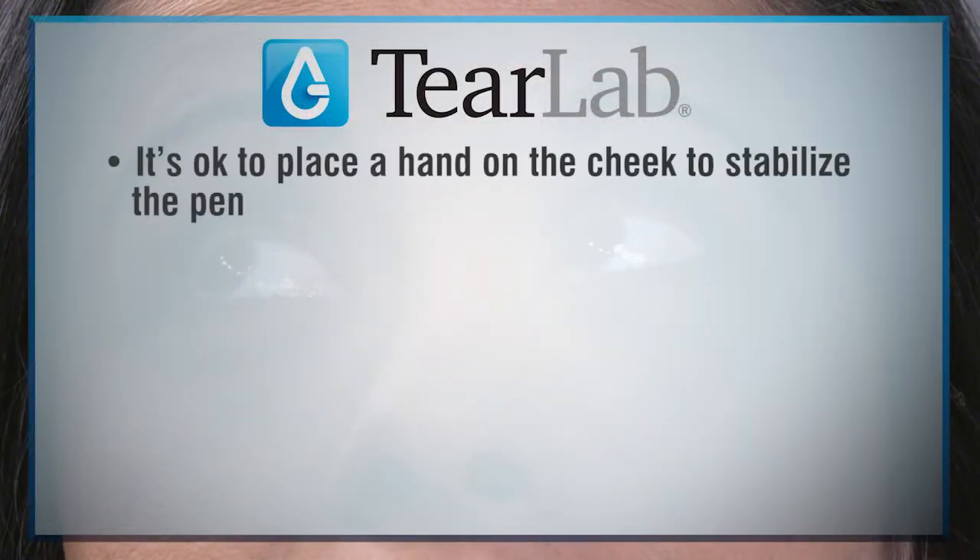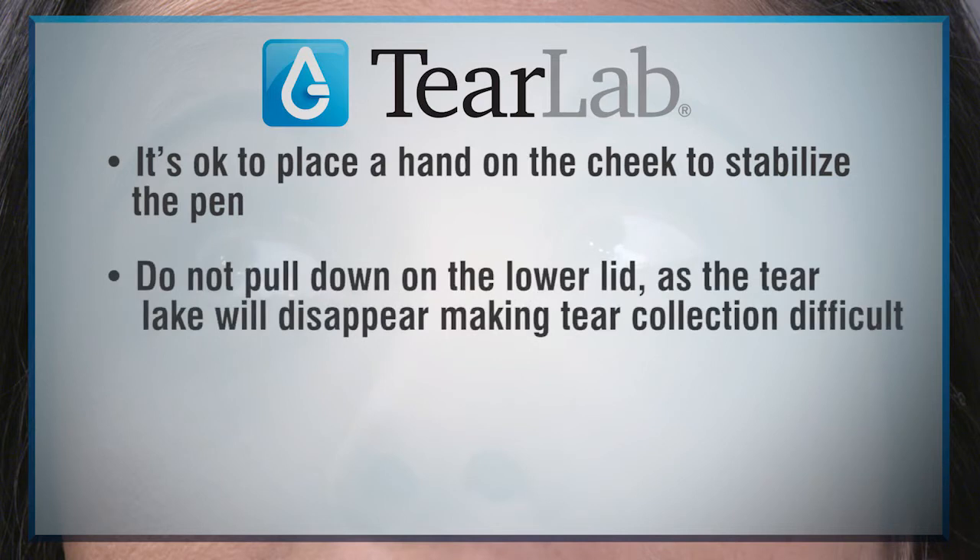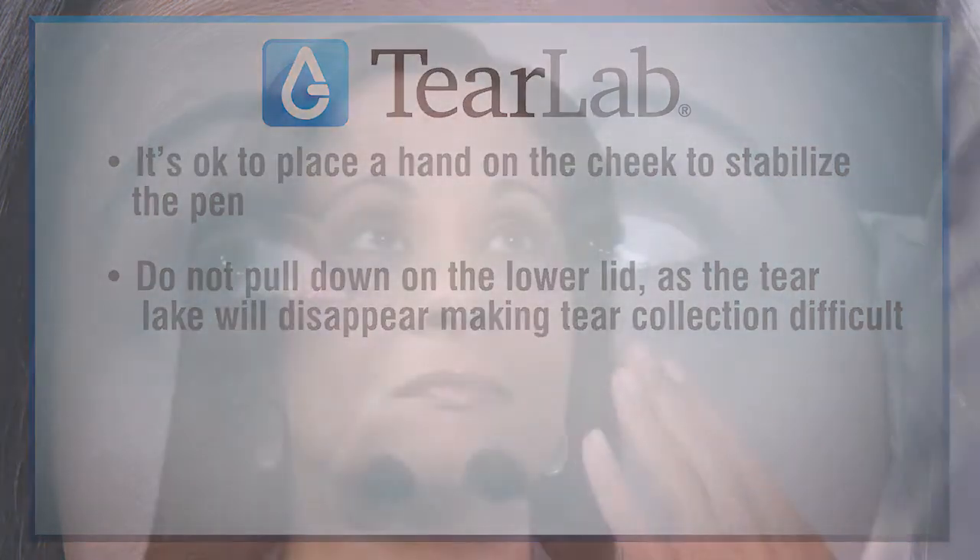It's okay to place a hand on the cheek to stabilize the pen, but do not pull down on the lower lid, as the tear meniscus will disappear, making tear collection difficult. Position the pen beyond the eyelashes near the corner of the eye. Tears are collected on the bottom of the tip of the test card.